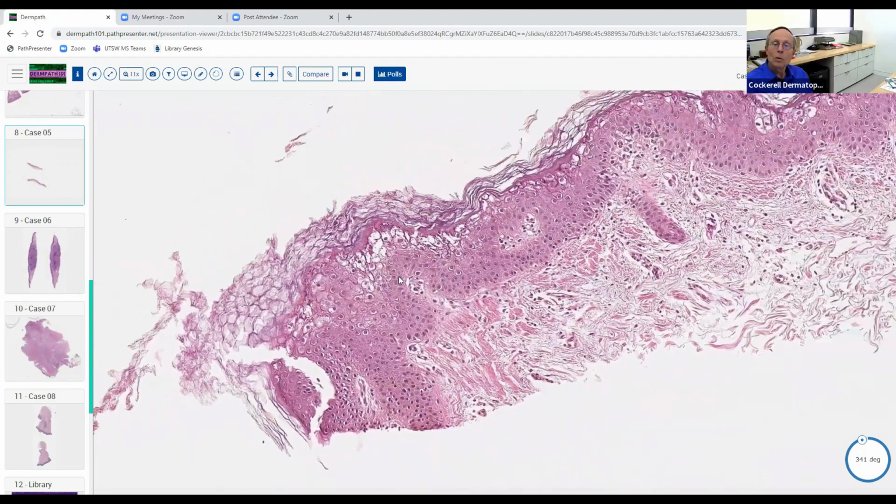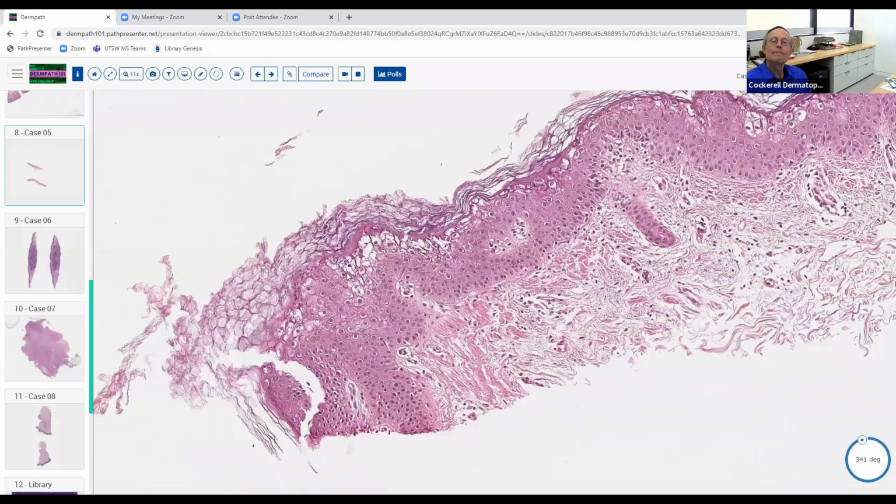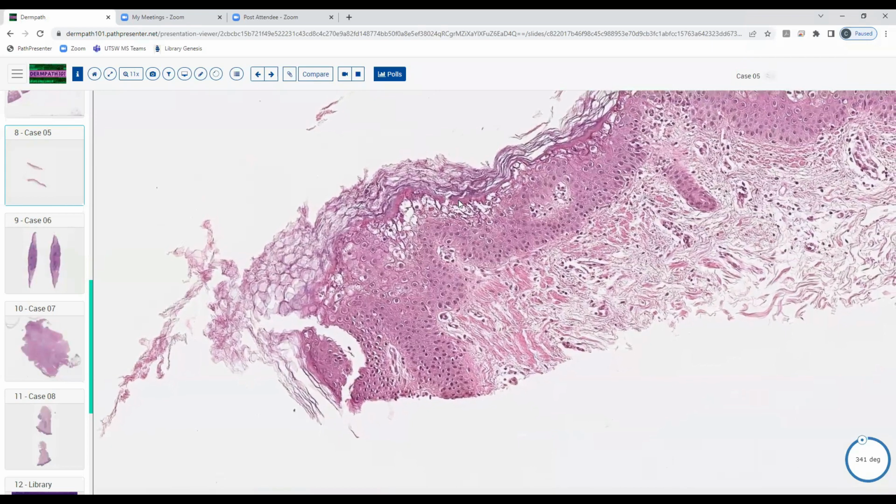What are some other conditions where you can see this histologic reaction pattern? I'm not sure. I'm sorry. That's okay. Well, you'll get it. Anybody else know where else we see this reaction pattern? Can you see it in some epidermal nevi? Yes, you can definitely see it in some epidermal nevi, the so-called ichthyosis hystrix, or the porcupine man. They get these very thick, large verrucous areas, eventually with spines that come out of their skin. And when you biopsy them, you see this histologic pattern.